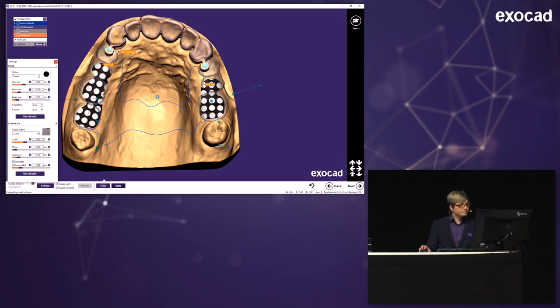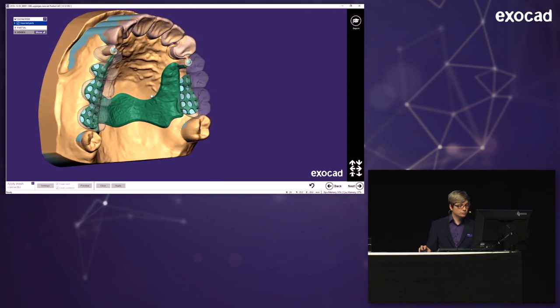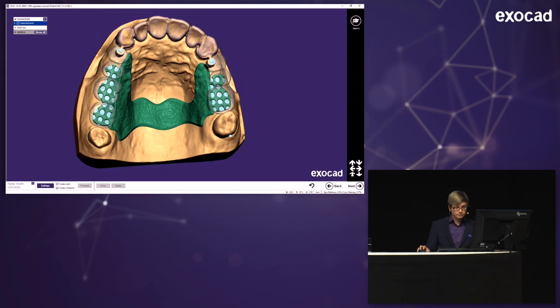So, as you may have realized, I didn't place the major connector inside the later metal dummies, but you will see what happens with them next. So this is our design for now, and I'm pretty happy with that. What you have to know is if you design the curves, the major connector and the retentions actually have to overlap, or there's a gap in between, and you wouldn't want that.